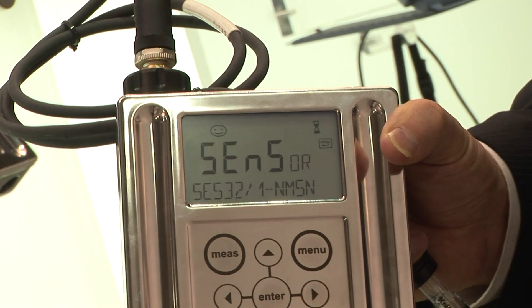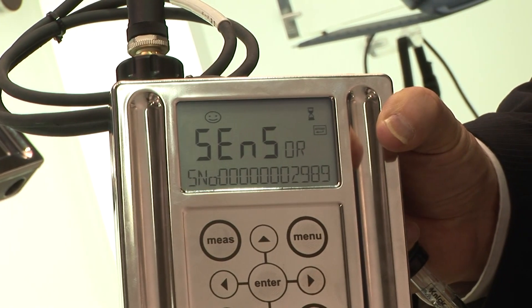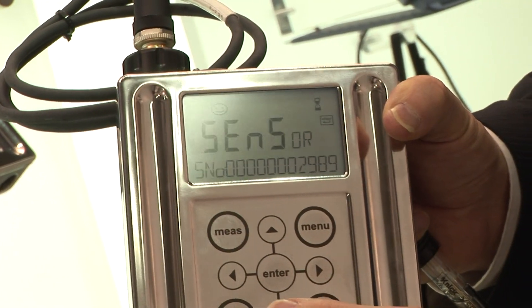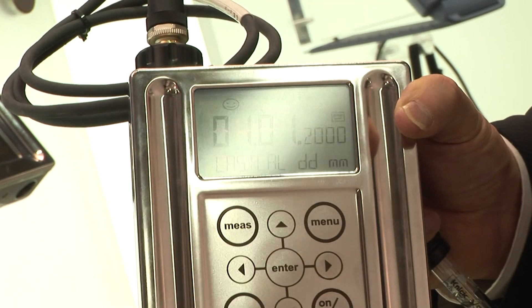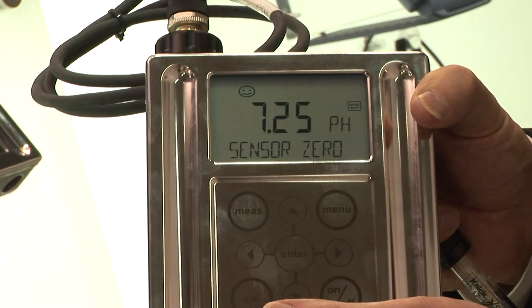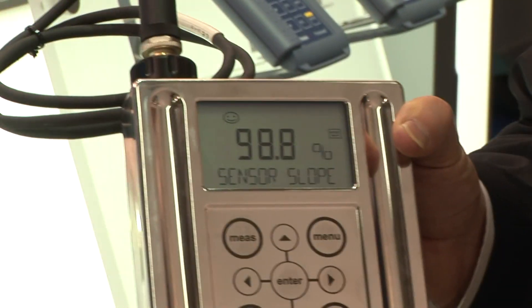You can see it's a memosense pH sensor — a 532 sensor — with a serial number, and we also have the last calibration values. This is something you will not find in any portable system on the market so far.